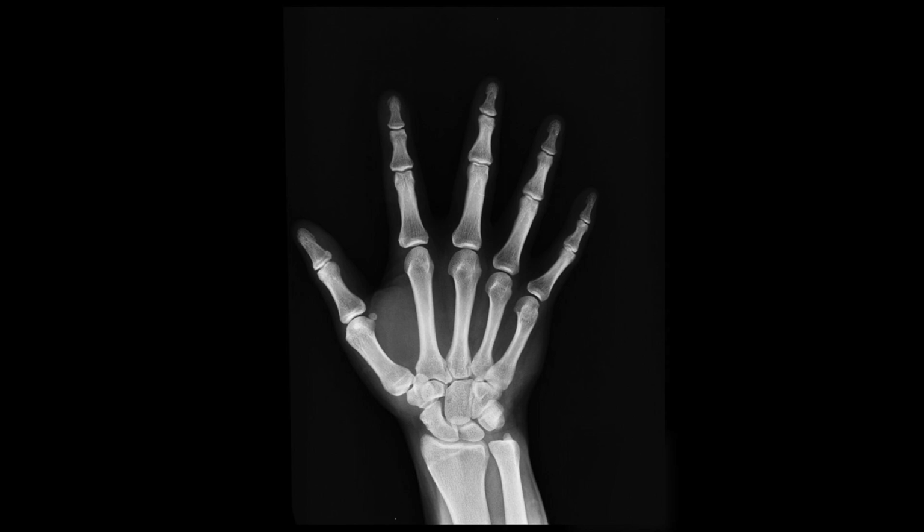The X radiation changes the film in such a way that an image of bones and any other dense objects in the body is created. This is able to happen because the dense objects in the body absorb or block X-rays from making it to the film. So where you're seeing bones on this X-ray image is where little to no X-rays touch the film.